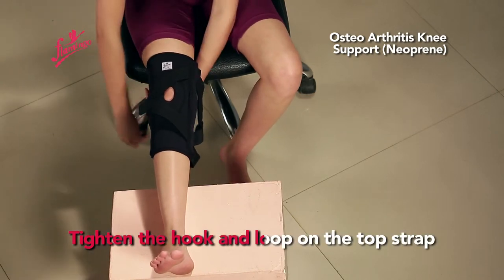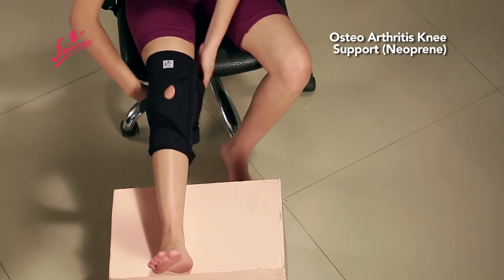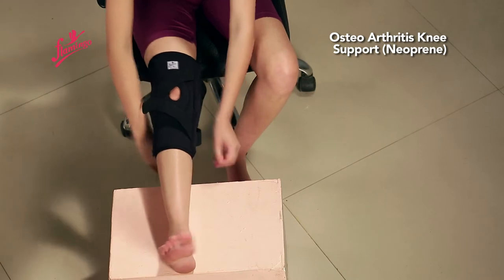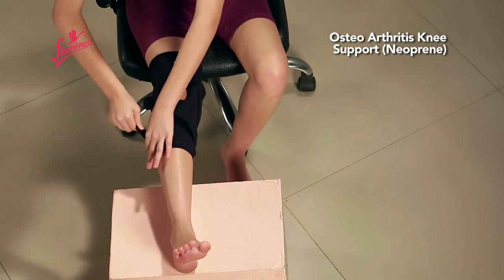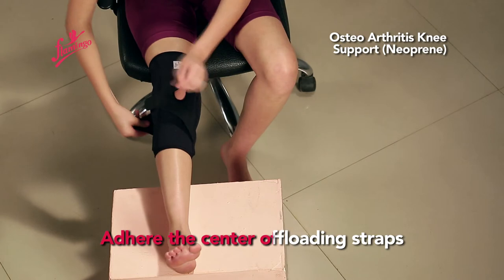Tighten the hook and loop on the top strap. Similarly, tighten the bottom strap to give a firm grip. Then adhere the center offloading straps.